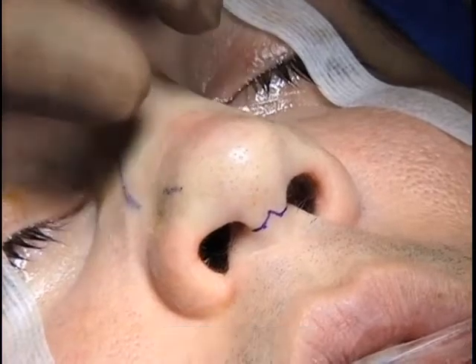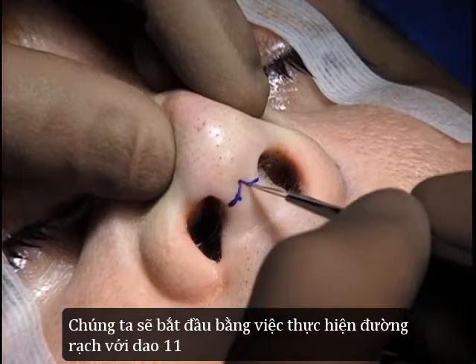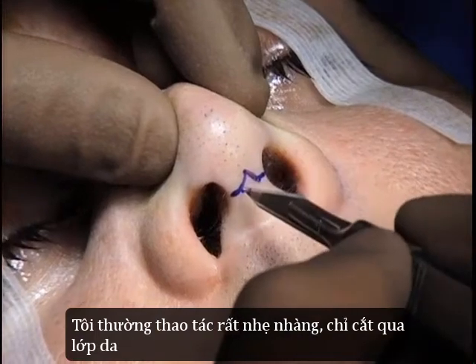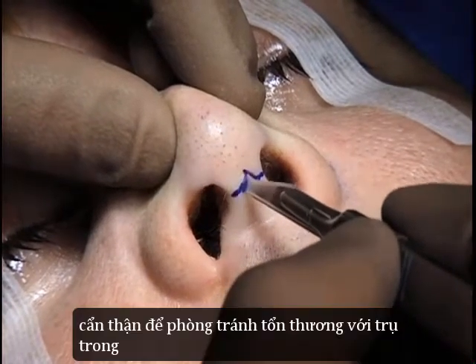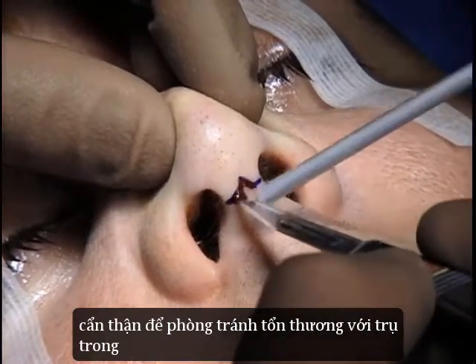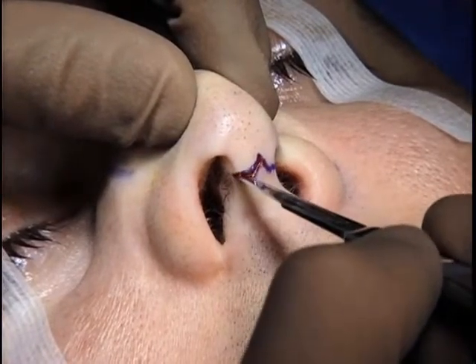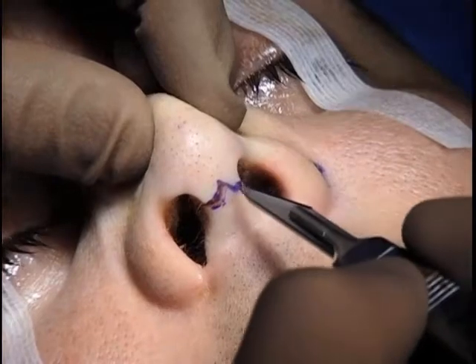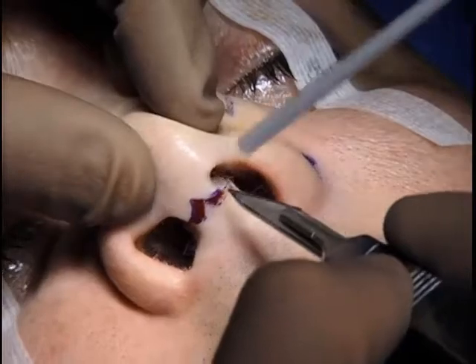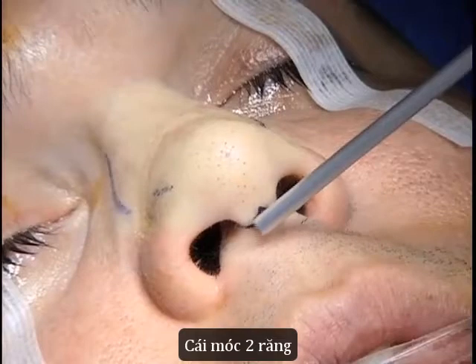Can I have an 11 blade, please? We'll begin by making an incision using an 11 blade. I use a sawing motion to execute the incision. Taking care to avoid damaging the medial crura as I move laterally. Two-prong.